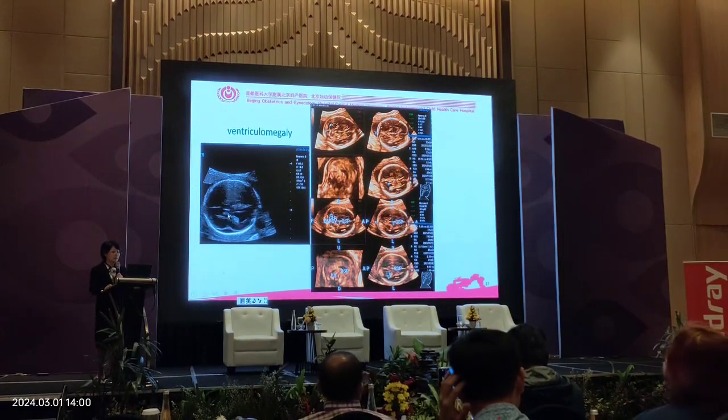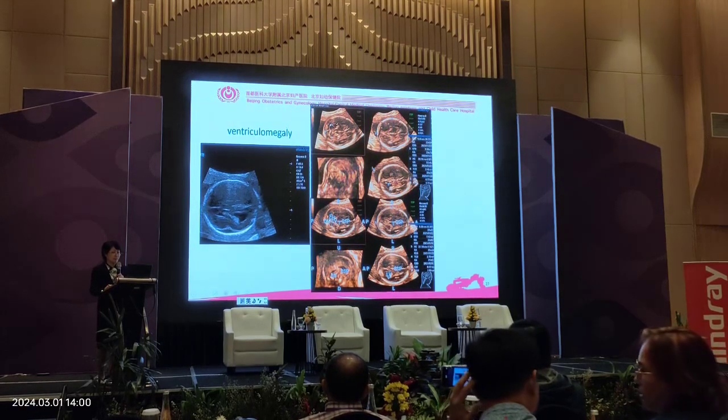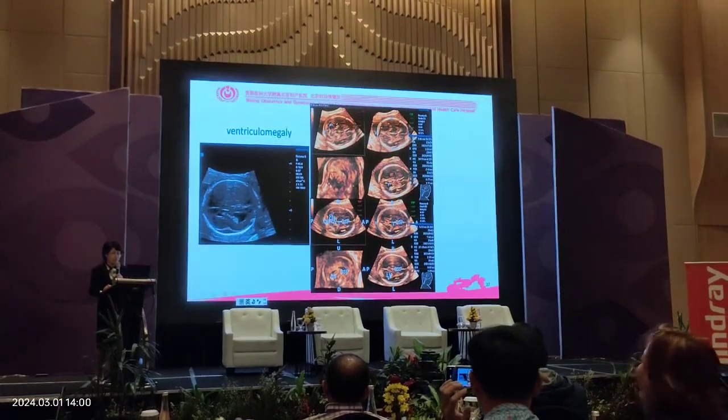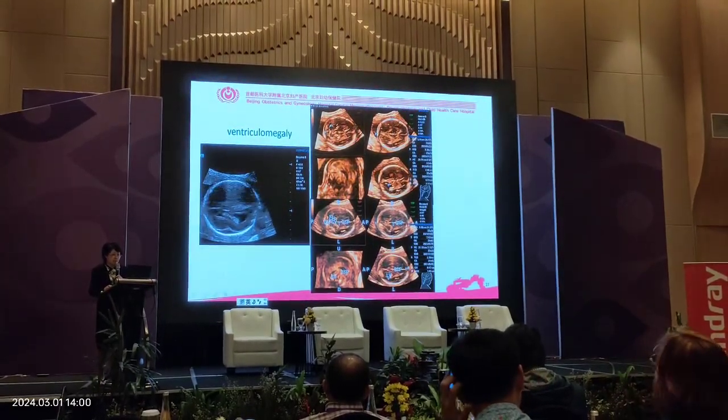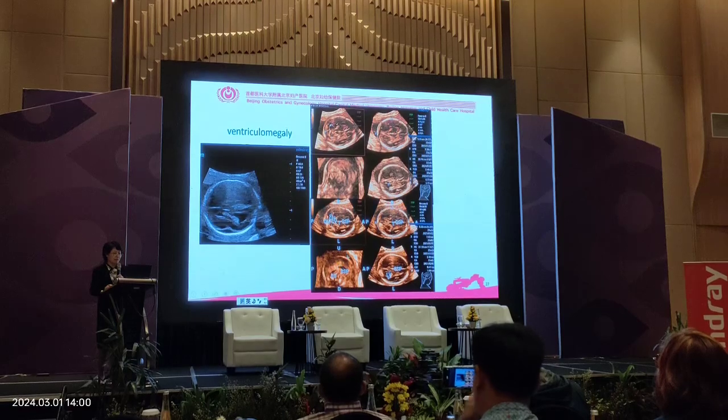The ventriculomegaly here, and we also use the smart plane to measure the ventricle, the widest lateral ventricle here, and the CSP can show everything.